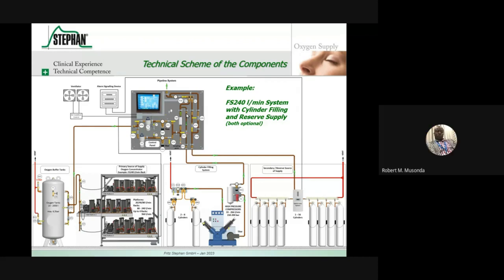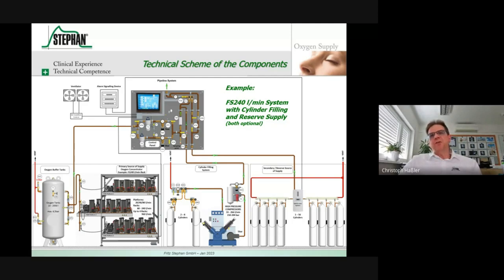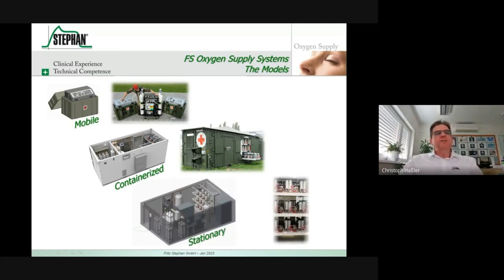My question is on the molecular filters in the oxygen concentrators. How often are those molecular filters supposed to be changed, or what's the lifespan? We have modules that run for over 10 years, or 15 years. That depends on the circumstances. In hospitals where you have a controlled environment, constant air conditioning, no movement, and systems running nearly all the time, we have a lifetime of 10 up to 15 years. We experienced that on the modular devices. Those little devices here, which are moved around and transported heavily by armies in cars and helicopters, might have a lower lifetime.